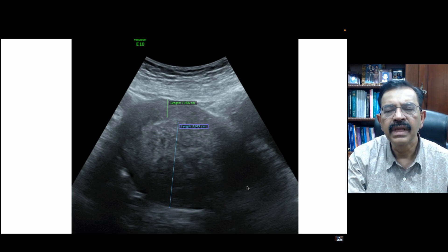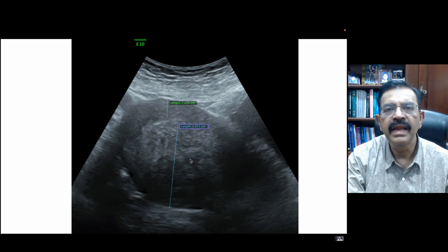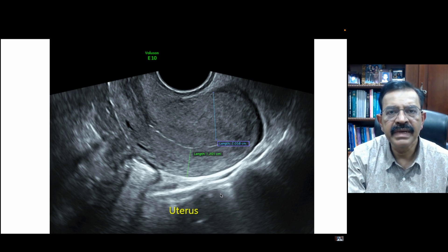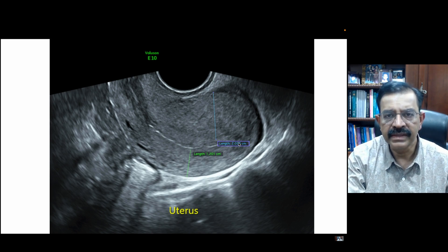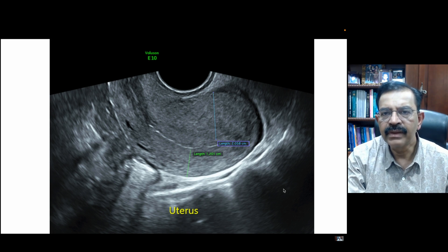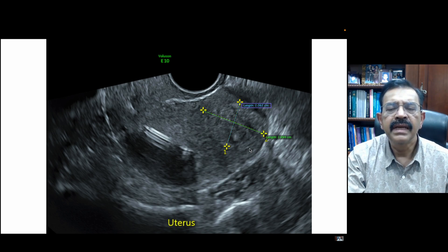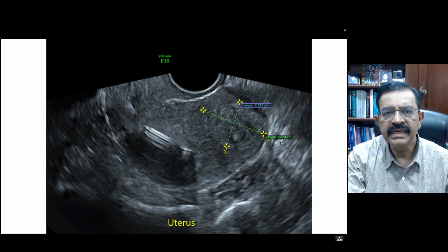This is an example of an adenomyotic uterus done by abdominal ultrasound. The anterior wall is very thin at 1.266 cm, whereas the posterior is very much thickened at 5.972 cm. This transvaginal ultrasound similarly shows an anterior wall of 1.2 cm and a posterior wall of about 2 cm, indicating most probably adenomyosis. We also see focal lesions — this lesion in the posterior wall of the uterus at the fundus, measuring 2 by 2.8 cm, is an adenomyoma.